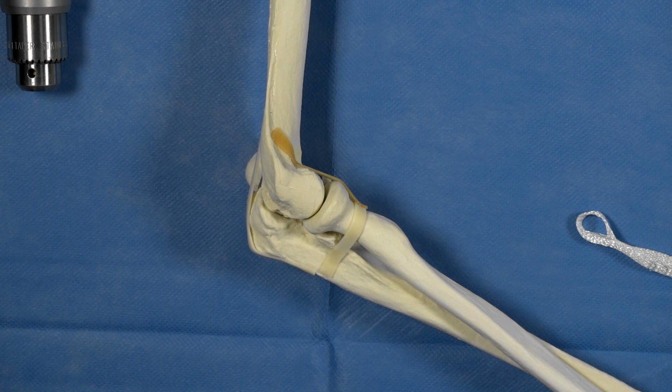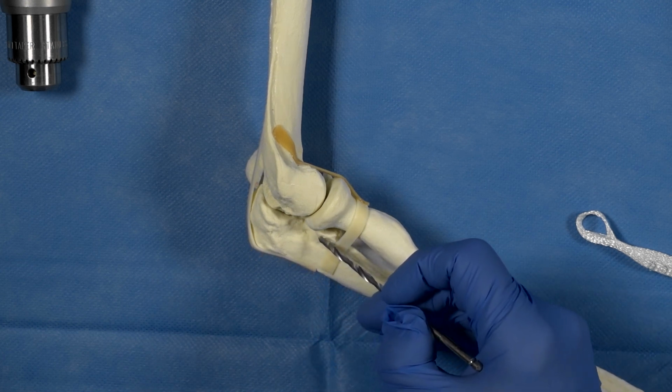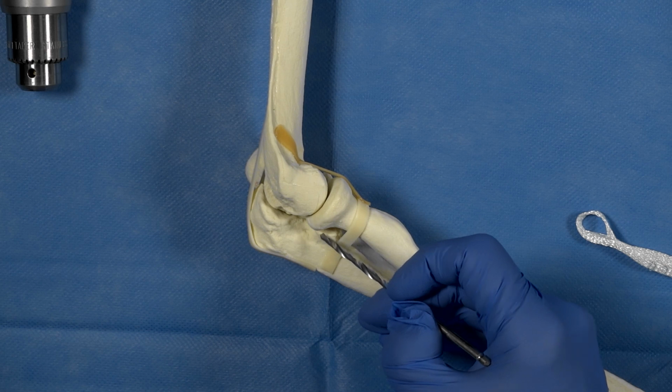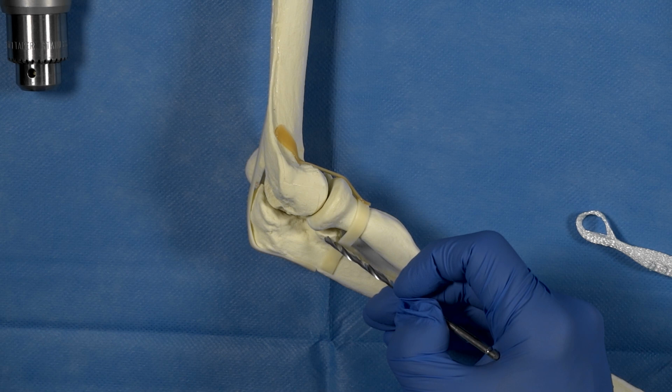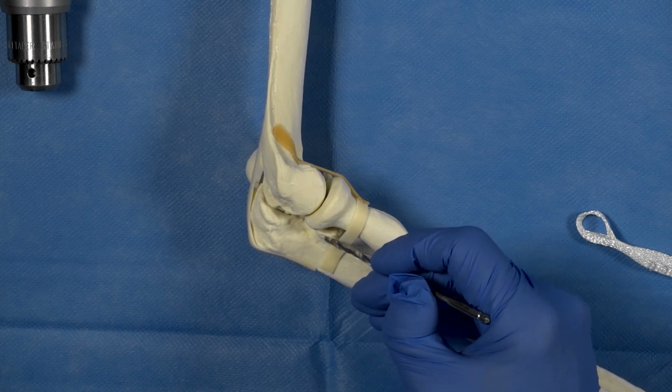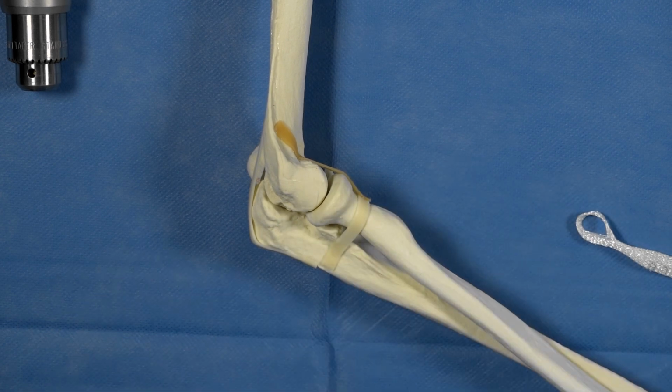On the ulnar side, we want to create a tunnel, and the positioning of the drill holes is important here. The first drill hole wants to be where the lateral ulnar collateral ligament inserts, and the lateral ulnar collateral ligament inserts at the head-neck junction of the radial head and just onto the supinator crest. So we're going to place our drill hole in this position, and we're going to aim towards where we, in our heads, have planned to put our secondary hole.